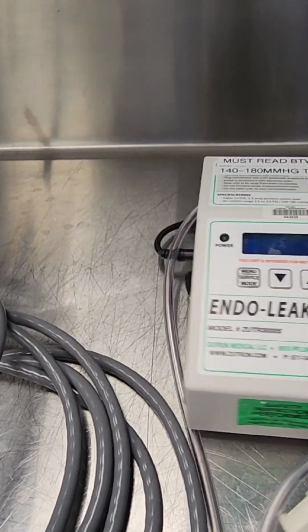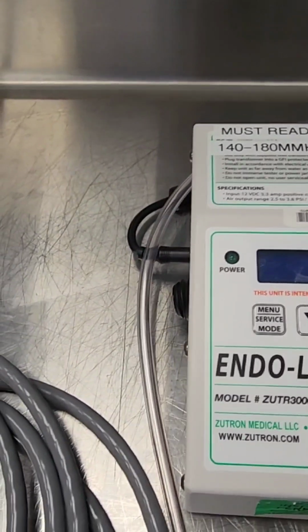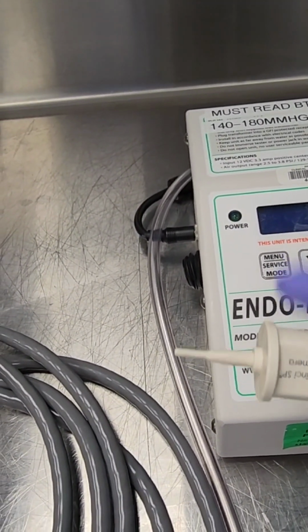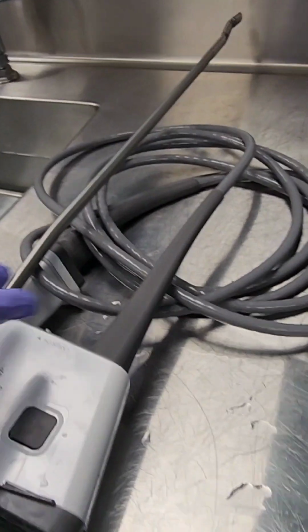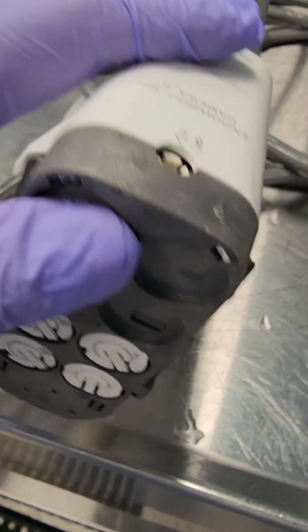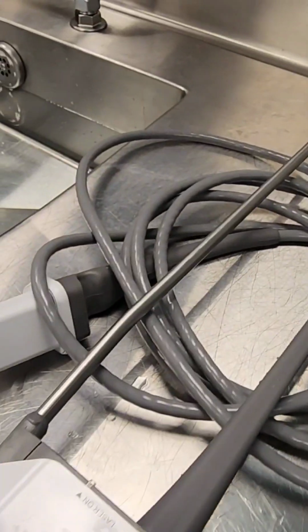Now, I'm not sure why the leak test is done after the cleaning process. It should be done before the cleaning process, but that's something that the manufacturers need to work out. So what you're going to need is a leak tester with a special adapter on it. You see that connector right there? That connector is connected onto the control body of the scope in a specific location, and that is where that location is on this specific scope. That's where the leak tester gets connected to.